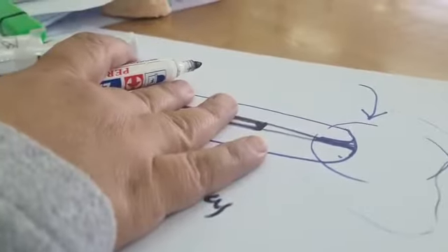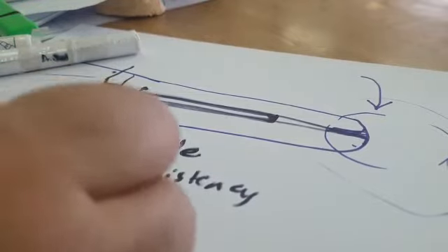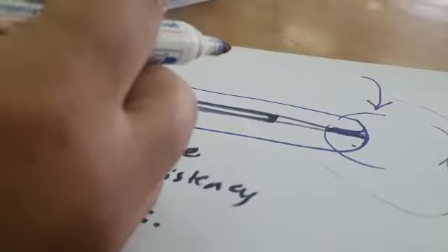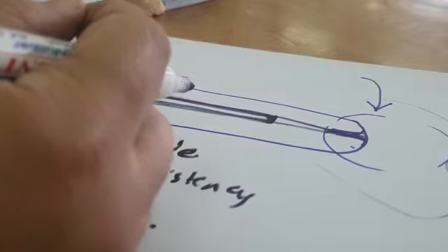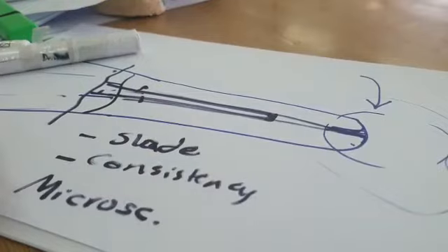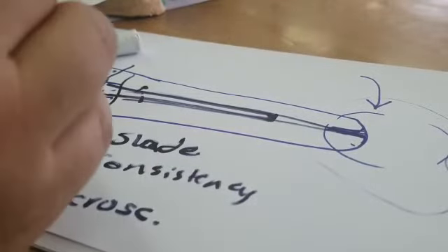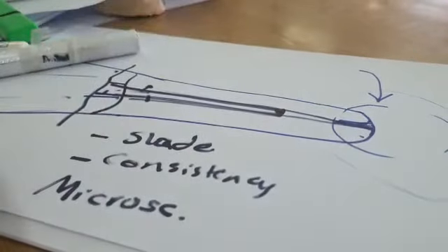Usually refer it back to an endodontist that has a microscope. Using the microscope, the endodontist is more skillful at centering his burs and going through, and he keeps checking with the microscope. You don't have this benefit. You don't have direct vision into the canal. So he has the microscope and it can reach inside, so he could verify that he's always in the center. So that endodontist is best under microscope. If you have a microscope as well in the clinic, you can do that. But it needs to be done under good magnification and a lot of intermittent stopping because you don't want to go into the dentine. Okay?